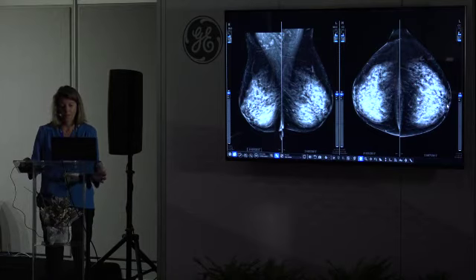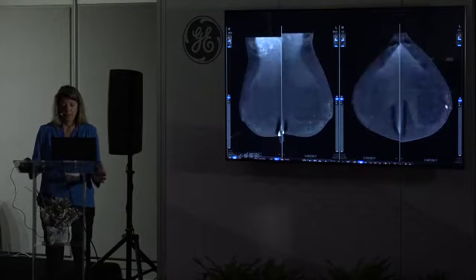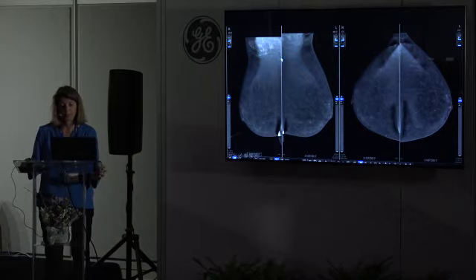So finally, she had contrast mammography and absolutely nothing. It was only glandular enhancement. So sometimes it looks like that, glandular enhancement that's very high. You see small normal uptakes for normal lymph nodes. Also, you can have normal lymph node enhancement. And a small breast-in-breast artifact, but not very important.